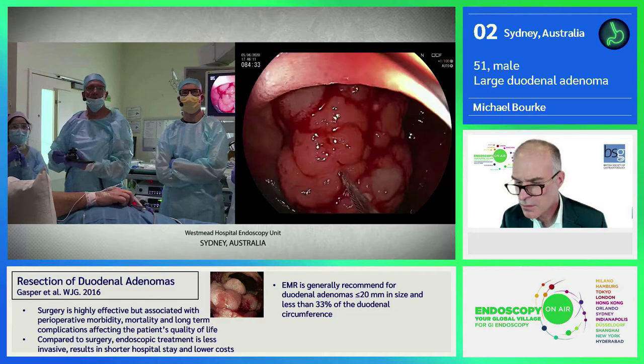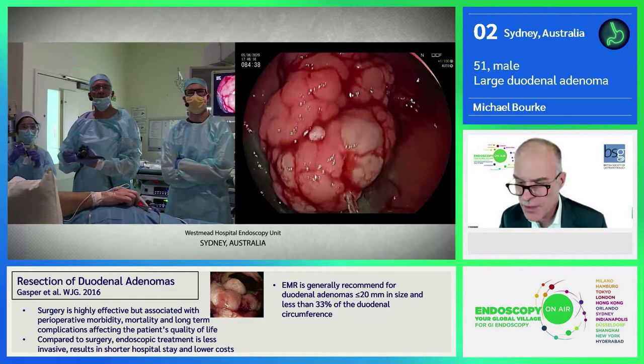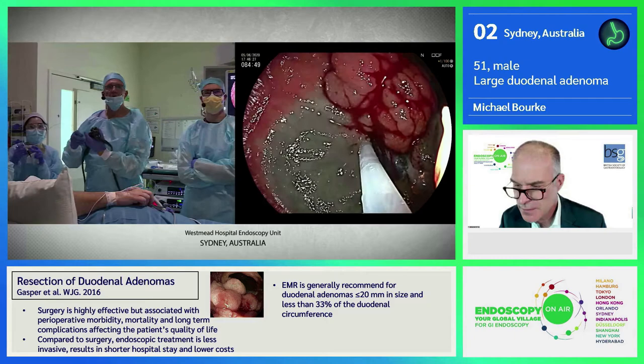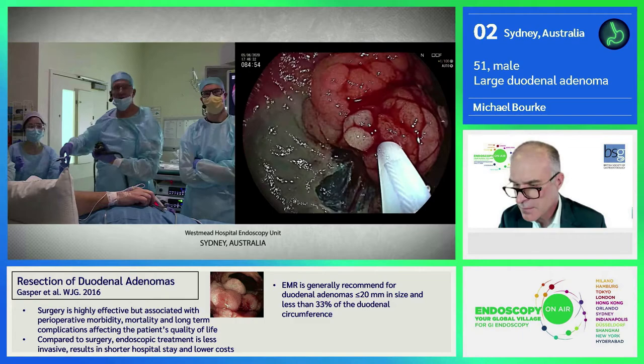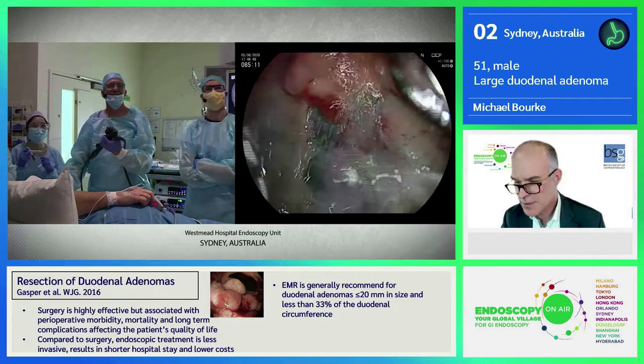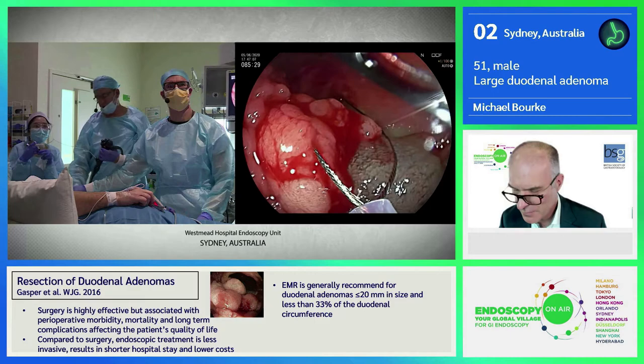But in a bulky lesion like this, even though you can't see the back of it clearly, as you debulk, you make space and it'll become easier to get onto the back. Exactly, yeah. Close. So sometimes you need to take the dominant nodule at the front of the lesion away, and then I don't think this is going to get easier, but so water jet, okay. So again, on this margin, just keep holding, good.